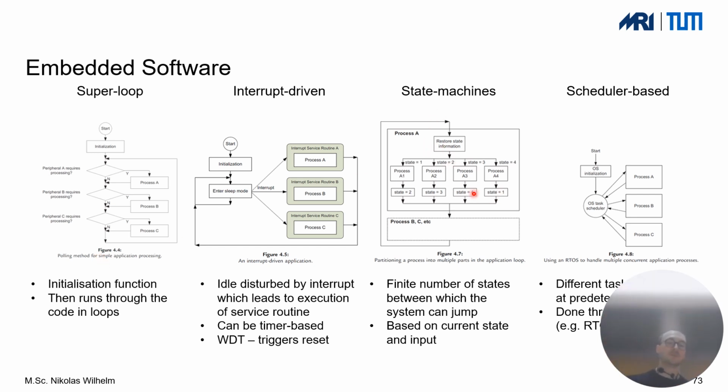And if you want to connect your system to a Bluetooth, and then your external application will send commands via Bluetooth, and you will then operate depending on those commands. Maybe it's smarter to use a so-called state machine, where the different states could be, for example, we are searching for external Bluetooth devices. We are now connected to a Bluetooth device, and we have started a measurement, or we will now be operating in a certain mode of that measurement. So state machines can be a very handy thing, and it's just for making the code a bit more understandable and for other users to be able to support your system or to understand what is going on.